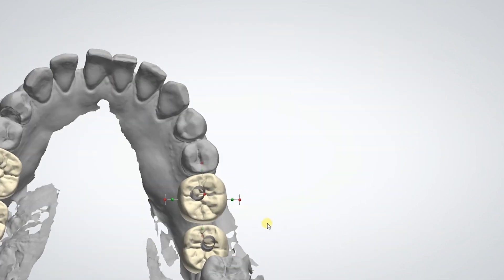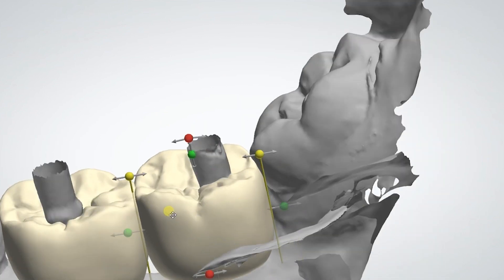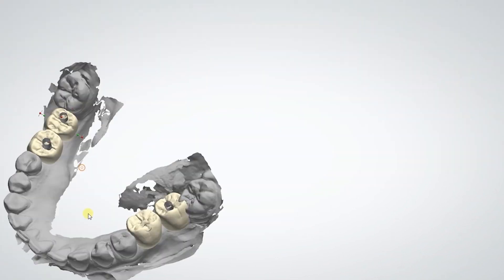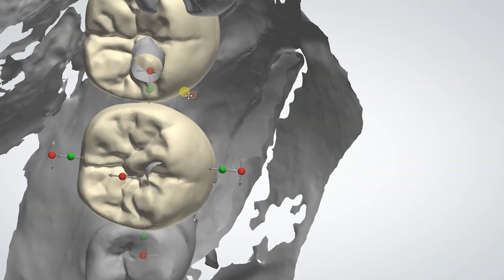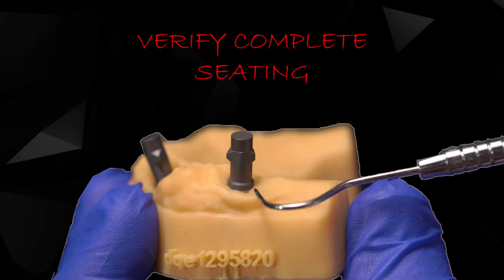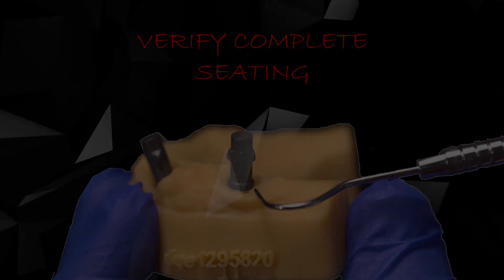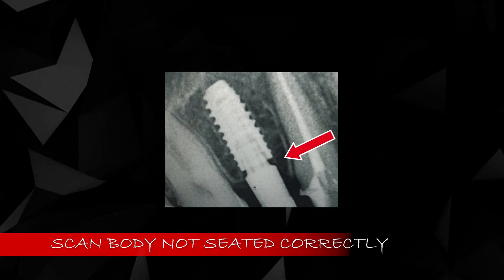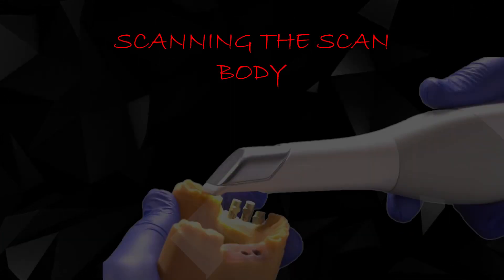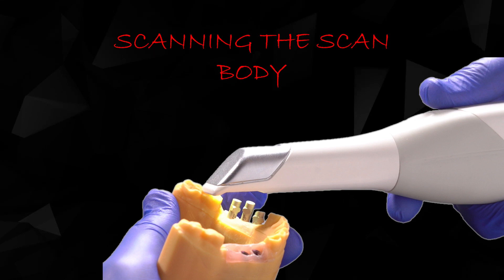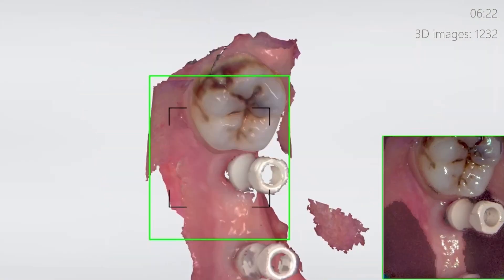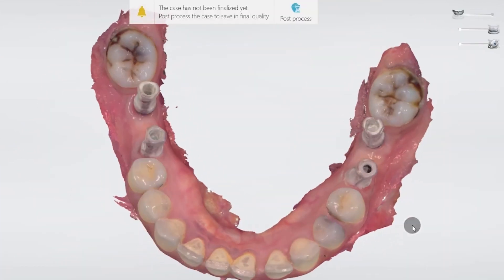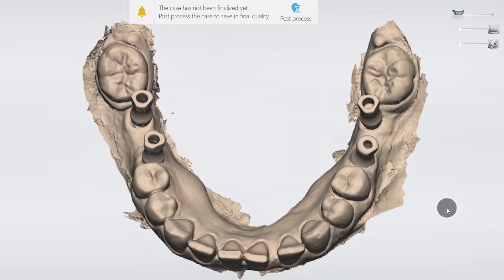The technician aligns the virtual scan body with the scan and designs the restorations in the CAD software. Once the scan bodies are seated onto the implant, it is crucial to take an IOPA and confirm complete seating — there should not be any air gaps between the implant connection and the scan body. While scanning, always make sure that the coronal portion of the scan bodies is recorded cleanly without any voids, distortion, or ghost images, as this area has critical aligning surfaces.